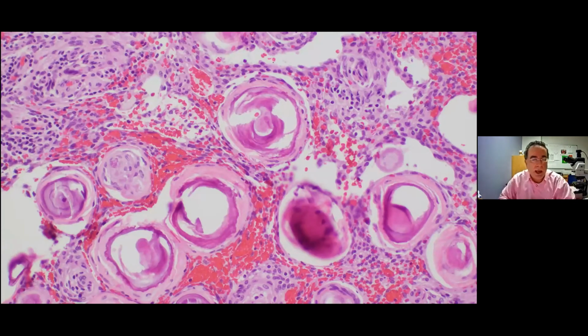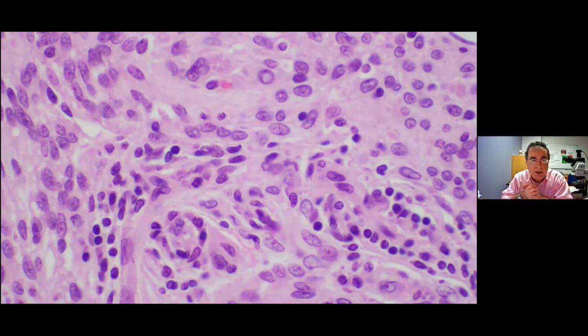They're basically, as opposed to dystrophic calcification or ossification, a laminar accumulation of calcium, which results in these lamellated spherical structures. Next slide. And at higher magnification, in the top center, you can see a pseudo-inclusion, and it has the same color as the cytoplasm.